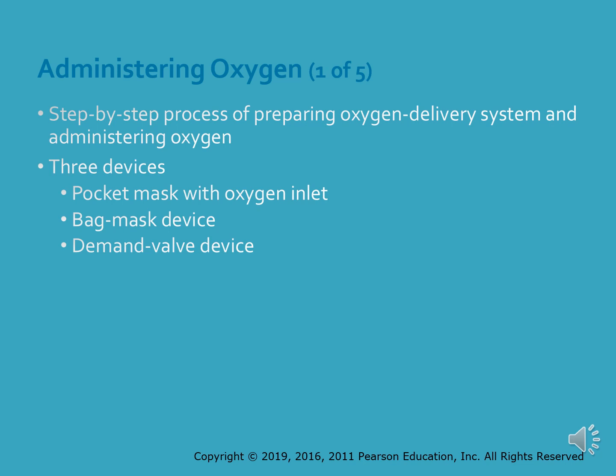Many bag mask devices have oxygen reservoirs, which is the long tube or bag, to increase the oxygen concentration delivered to the patient. Used without a reservoir, it will deliver approximately 50% oxygen. Used with a reservoir, it will deliver an oxygen concentration of up to 100%.